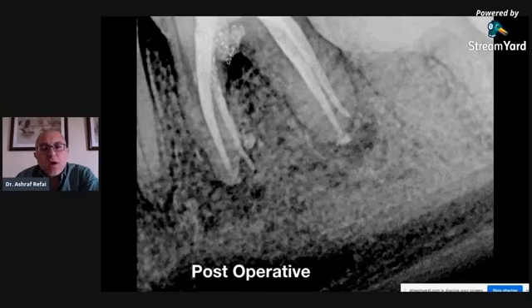The reason why, in my opinion, the dentist fractured this instrument, simply, she had a very limited mouth opening. She would only have about maybe 1.5 centimeters between her incisors, and working in the molar area was very difficult and very cramping for me. So this took me quite a long time to reach this end result, or quite a number of visits.